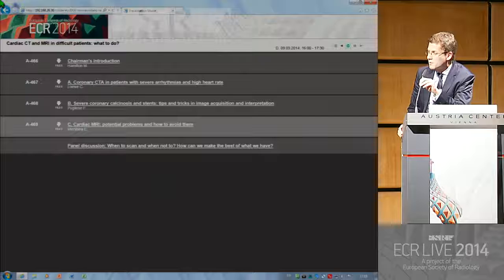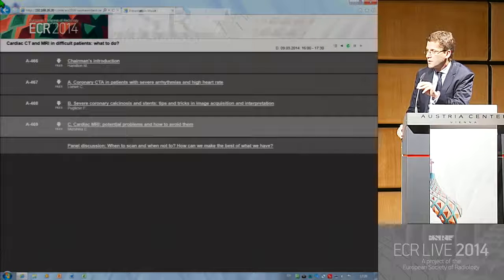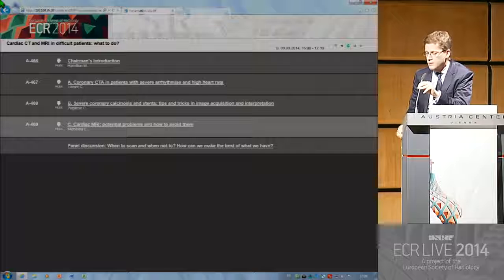In general, I agree with you, but I think it depends a little bit on which scanner you are using. If you have a really fast scanner providing the high pitch mode, it seems to be possible to definitely rule out aortic dissection even without ECG gating. But if we leave the high pitch mode aside, I fully agree with you, and it's the same experience in my hospital.